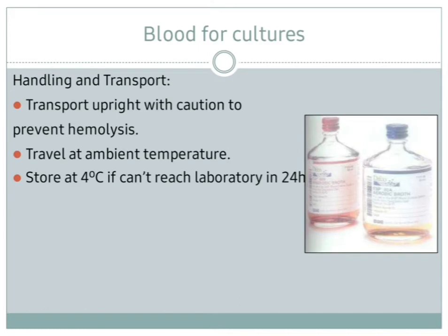Now, important regarding the blood for cultures, that the transport should be in upright position with caution to prevent hemolysis, because the rapid movement of the blood will cause hemolysis, and this will give us a false result.